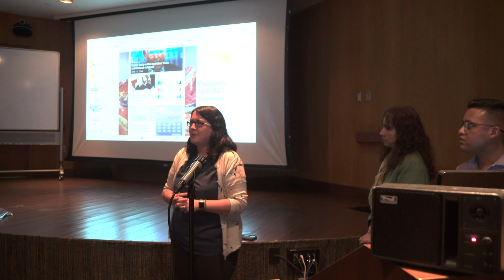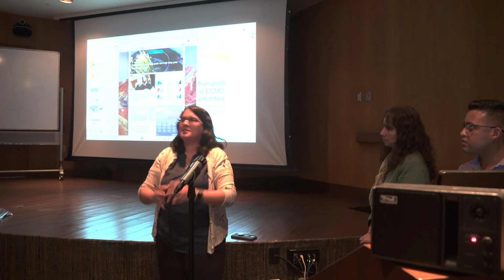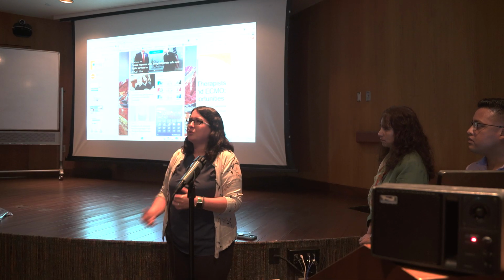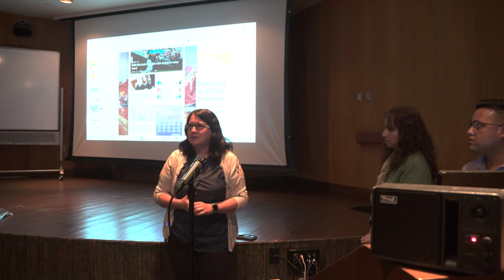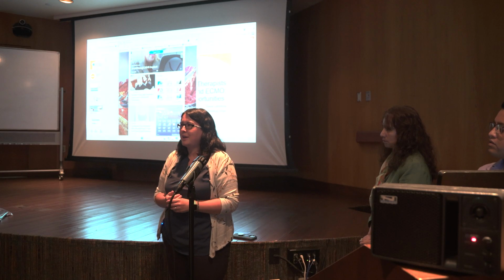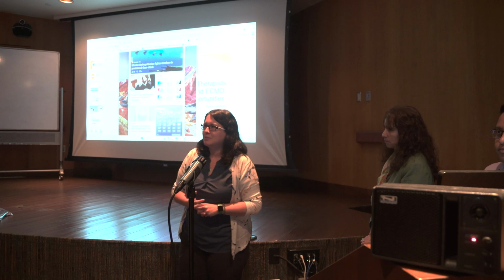You guys probably have all the time when you're like, oh my gosh, why did they turn up the PEEP? Or why did they turn it down? It's because people are getting impatient. But this is giving you a tool to say, here's more of what we can do. And how can I get that dialed in? And looking at things like collapse and hyperdistension, because once that collapse starts, especially with somebody who's super non-compliant, you're just clawing your way back up to get that lung back where you need it to be.